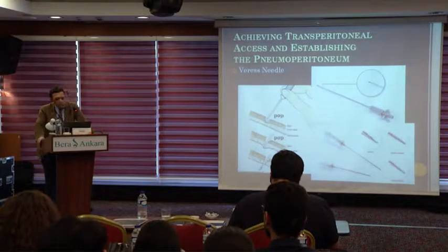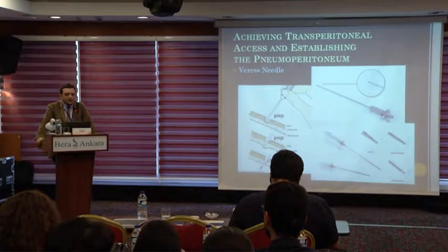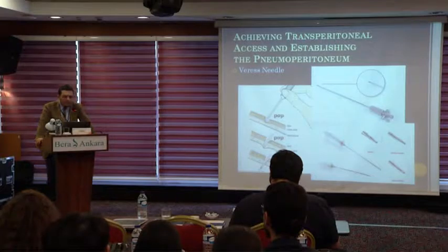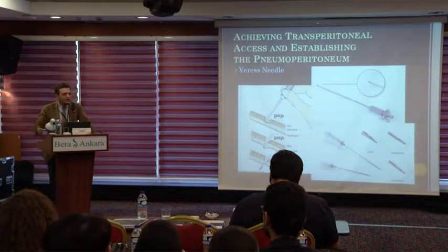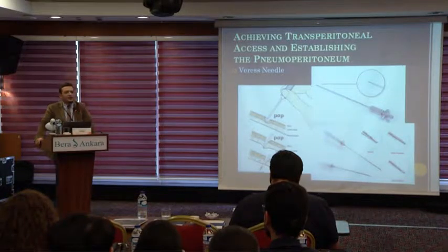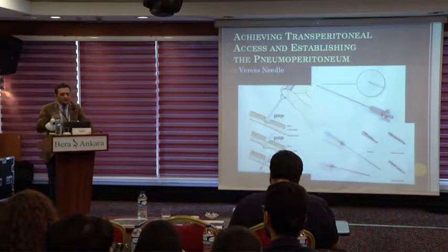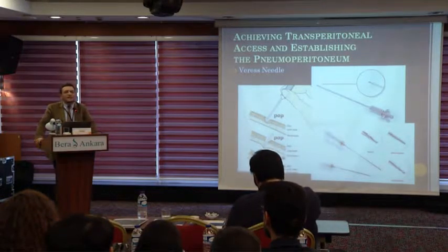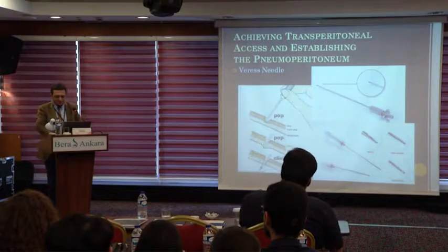You can use a disposable or reusable Veress needle. Maybe it could be a trick to use the disposable one, for first and single use. It would be better because it's a very narrow needle and there's a spring system in it. If a blood clot or a piece of tissue gets inside it, it jams the spring system. So if you don't have the pop and click mechanism, you can't get access, and maybe this can lead to some bowel complications.